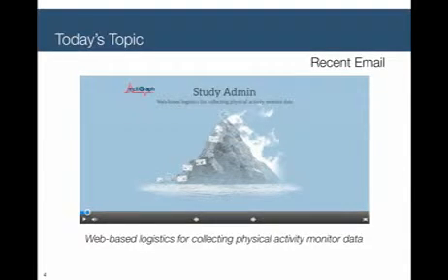As I'll discuss in the next couple of slides here, our devices are capable of collecting very high resolution accelerometer data, which is represented by that middle graph there, as well as summarized epoch level data, represented by the graph on the right, which is essentially integrated area under a curve. Now, for many of you, you'll know exactly what I'm talking about when you see these two graphs, but for some of you, I want to clarify, and so we'll do that.